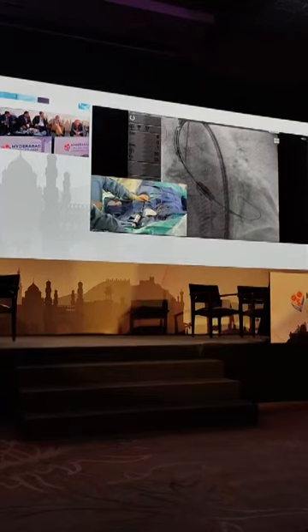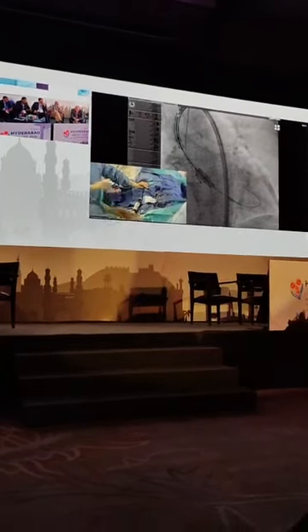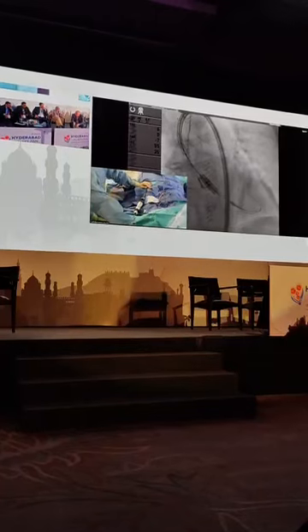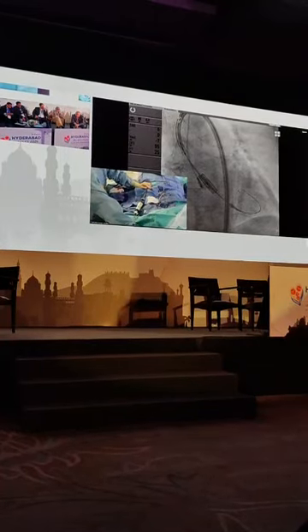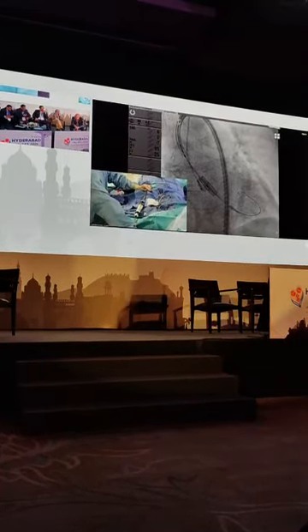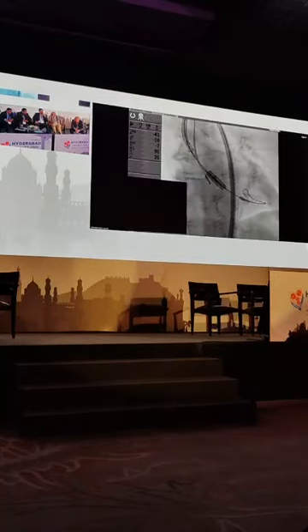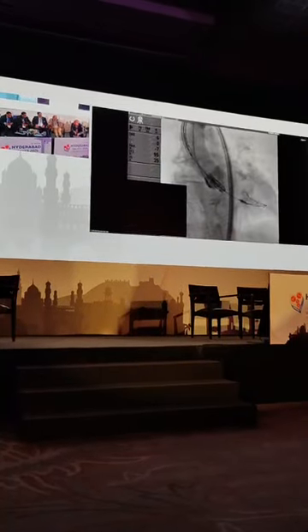And usually the marker has to be at the level or just above. And we do it on rapid pacing because rapid pacing will be done for valve positioning. So we do it at the same time. So 180. Stop pacing.